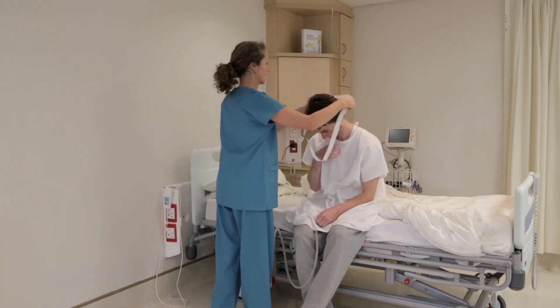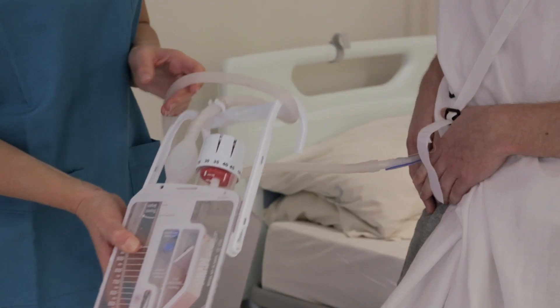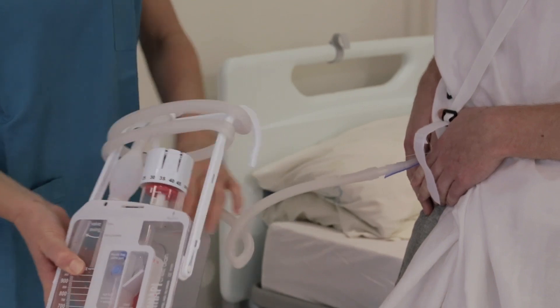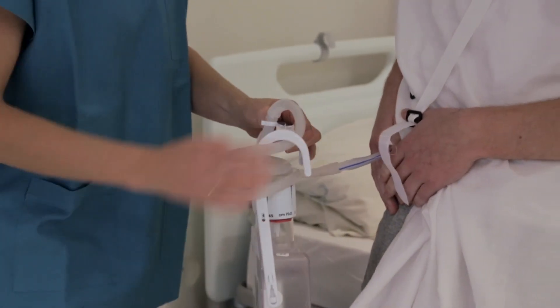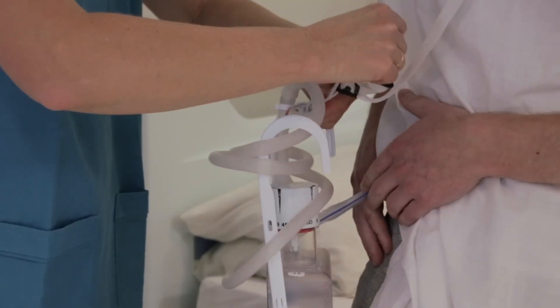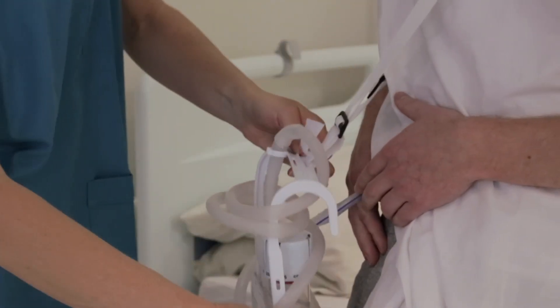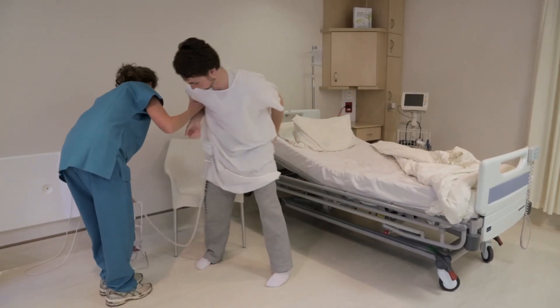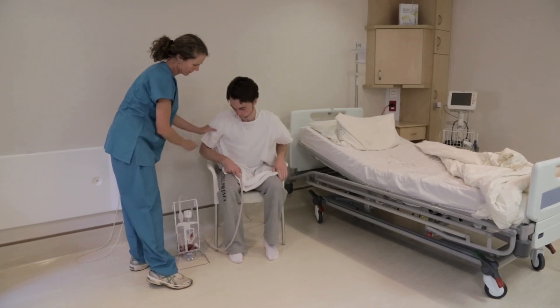When patients start to mobilise, a shoulder strap is used. Coil the drainage tube around the handle to prevent dependent loops in which fluid collects, compromising lung re-expansion. A stand is available in which the device can be placed when the patient sits out in a chair.